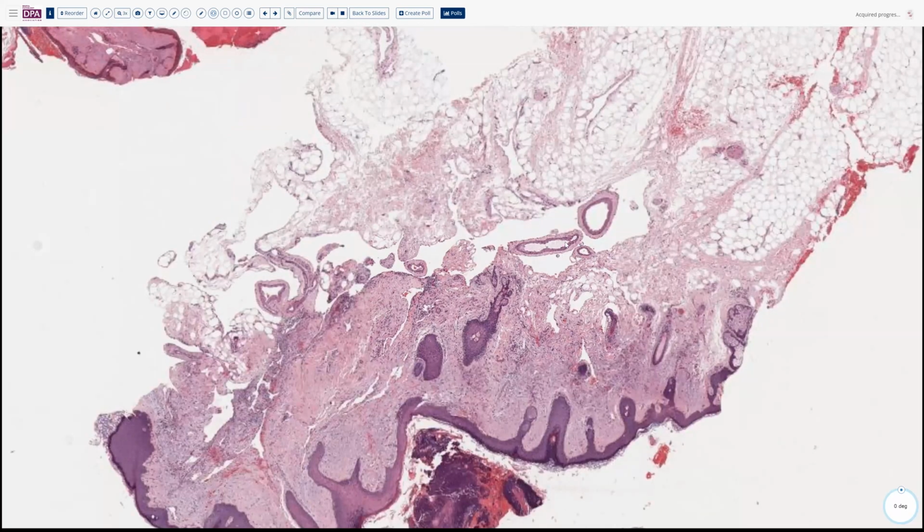So here you can see how it sort of erodes the tissue almost around these vessels, or extending up into the dermis and around some of the adnexal structures. Here you can see it around a hair follicle and so forth here again. So it has this sort of permeative pattern in this situation.